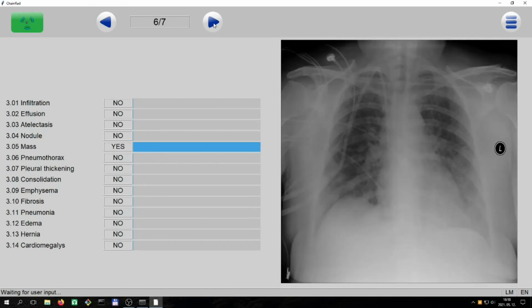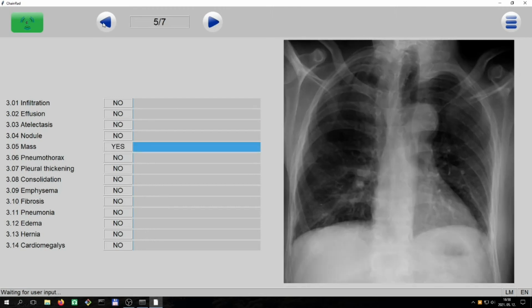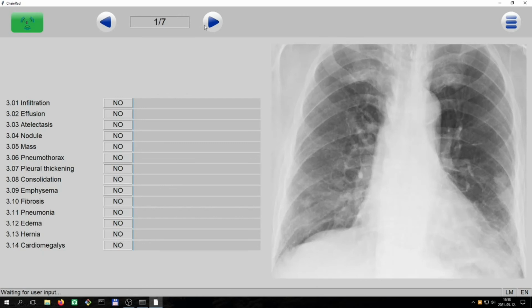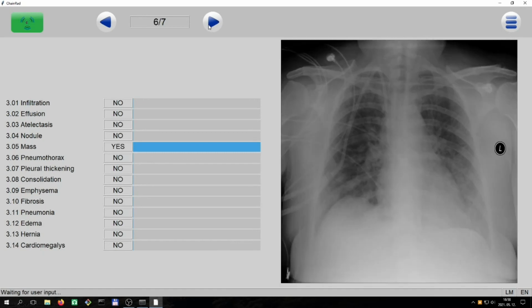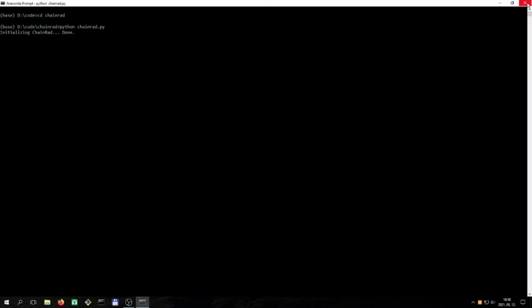We are thinking this state of ChainRad is rather a proof of concept than a production-ready software, though it has significant performance at the moment as well. In case ChainRad would have a chance to get developed further, we would retrain the famous computer vision architectures from zero to get more healthcare-compatible networks. Why? Because we think healthcare images significantly differ from pictures of the ImageNet.